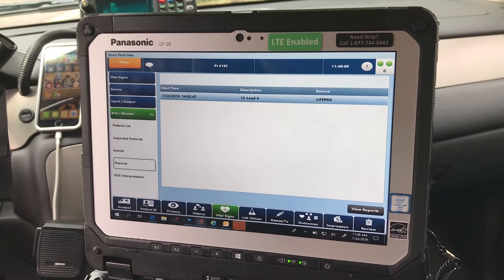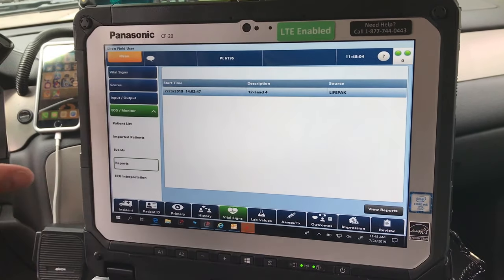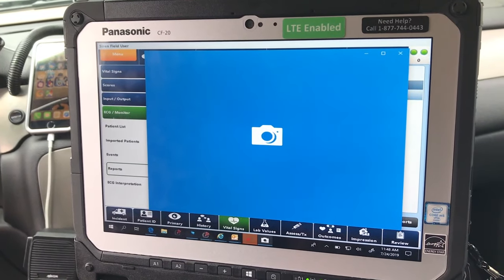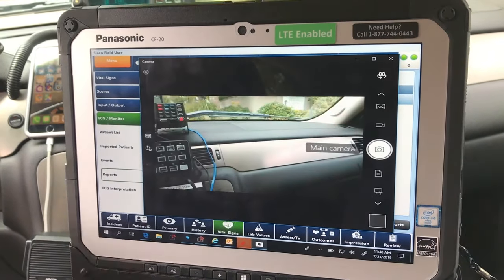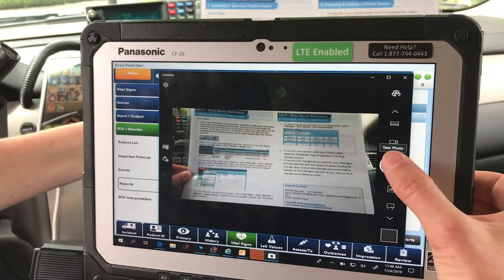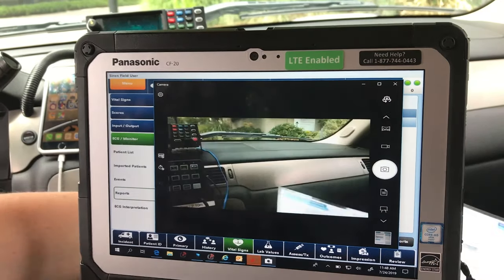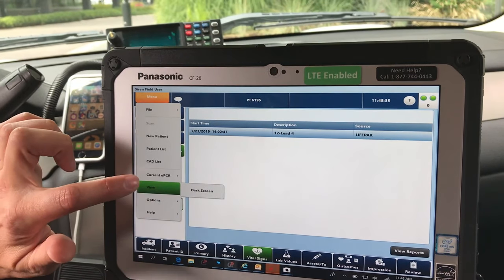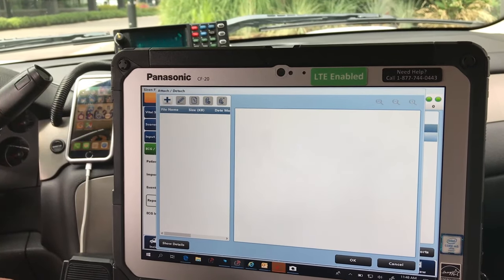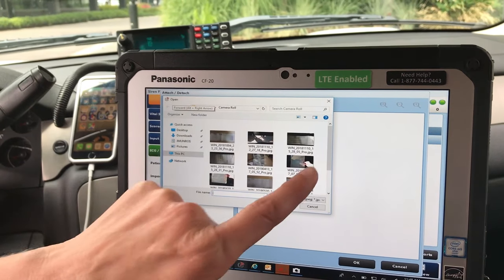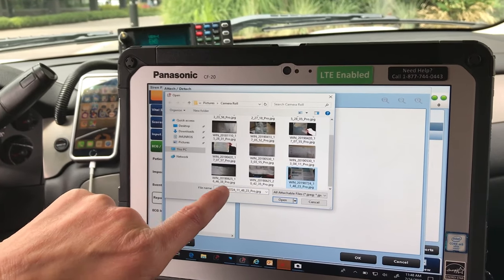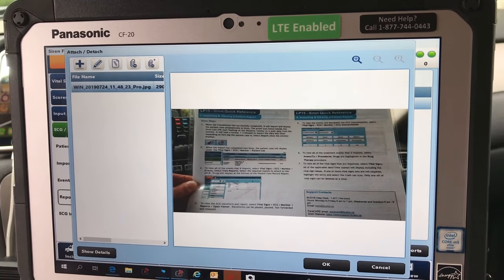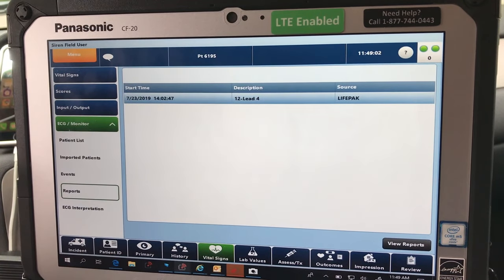If you want to take a picture of a 12-lead — or anything for that matter — and attach it to your Siren document, just go into the camera, type camera, and pull it up. Take the picture. Then to attach it to Siren, go to Menu, Options, Current ePCR, Attach and Detach, Add. Find the picture — it's the last one. You can rename it, but for speed I'll just press Open, confirm that's the picture you want to attach to this file, press OK. It will be a permanent document within your Siren.